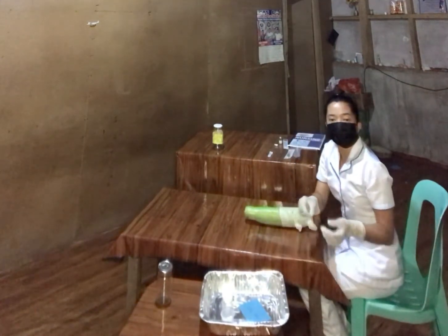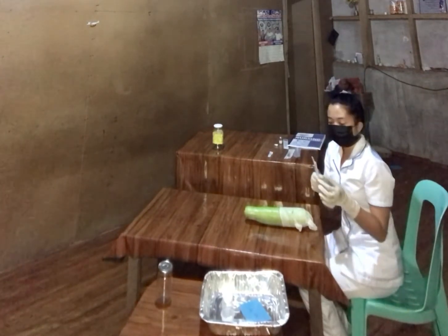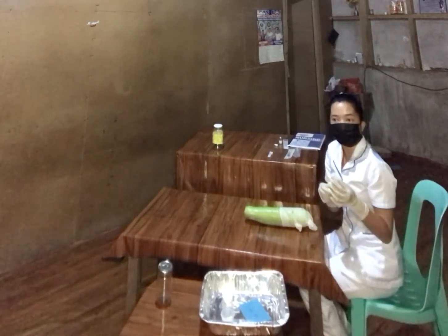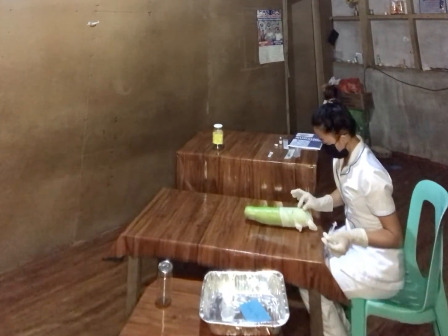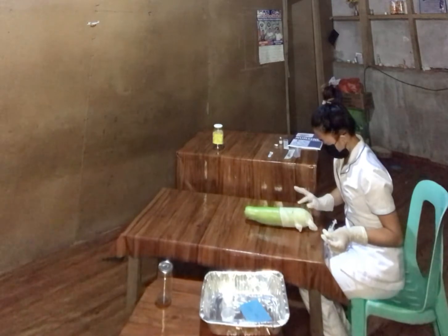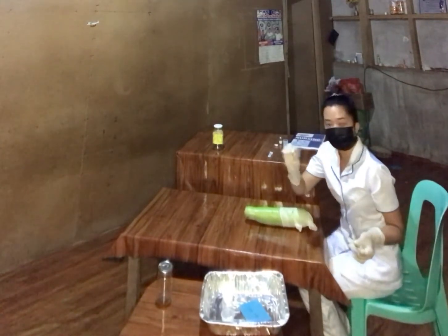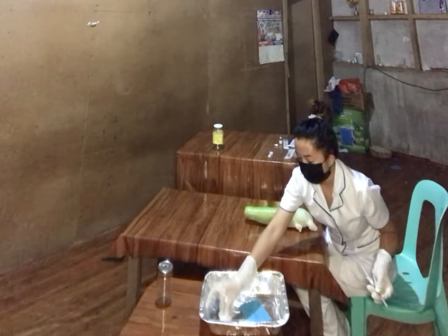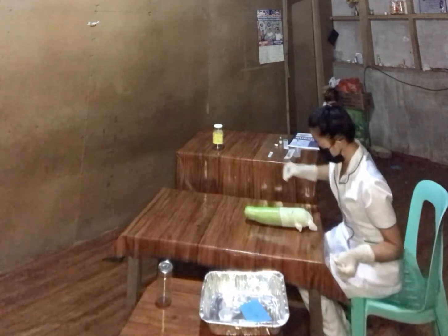Now choose the injection site, free of lesion and discoloration. So now I will check this. So I will use this cotton to clean this vegetable.